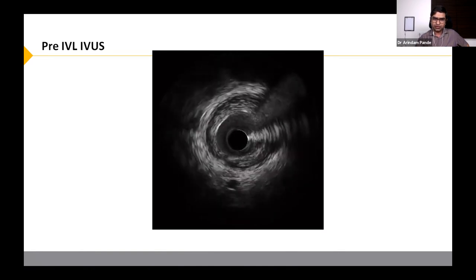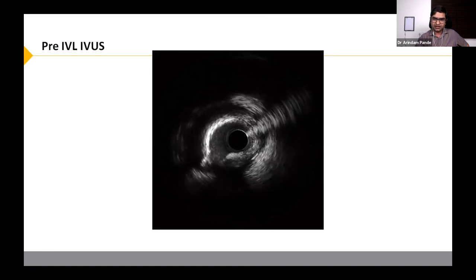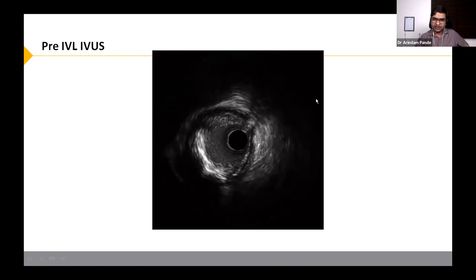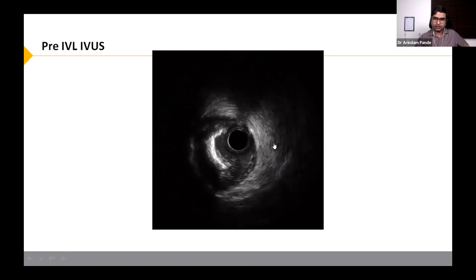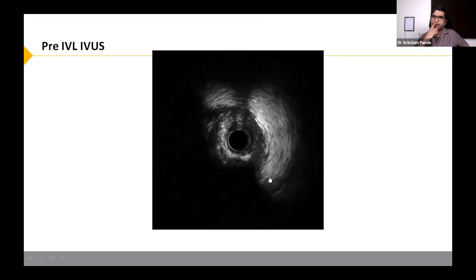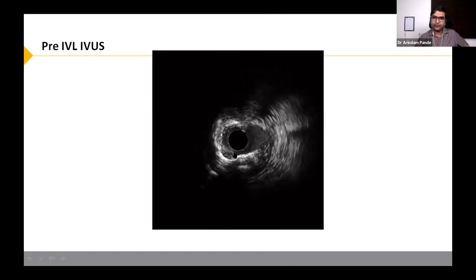And as we come back more proximally, there are some speckles of calcification which are visible at this point at 11 o'clock, 12 o'clock. Then it is getting tighter and tighter. And the calcification also is getting more dense. And very interestingly, we can see the intimal calcification at this portion, and at another portion we can see definite medial calcification at 1 o'clock, 2 o'clock, and 3 o'clock. So both intimal as well as medial calcification, very tight lesion. In spite of predilatation with a 2 millimeter semi-compliant balloon, the lesion was very, very tight. This is the LAD. We can see almost 360 degree calcification, very tight.